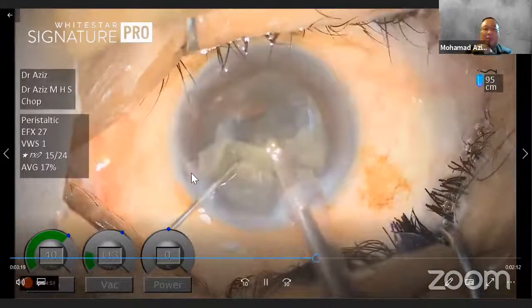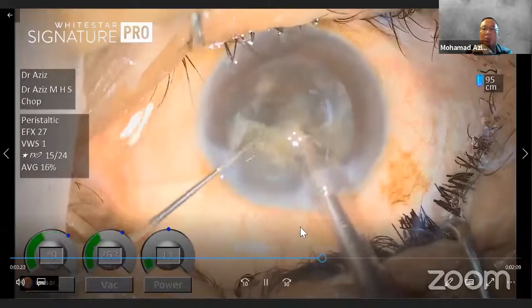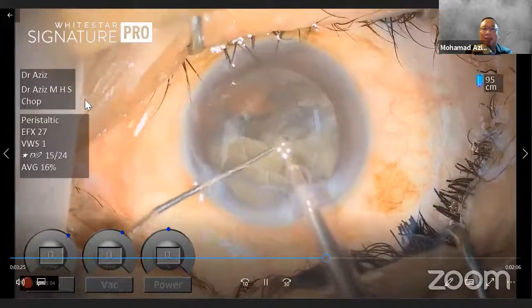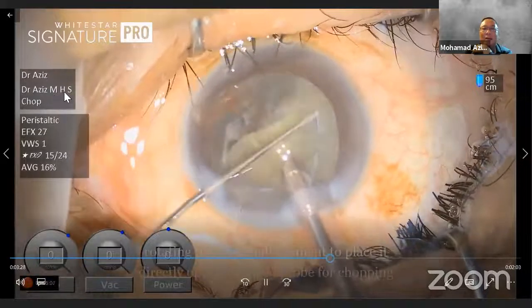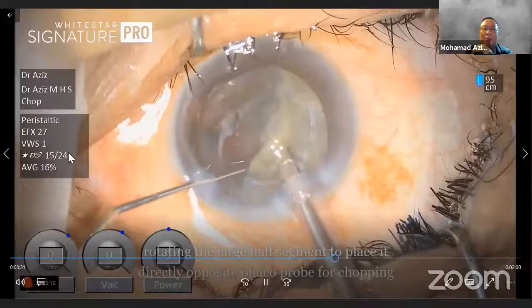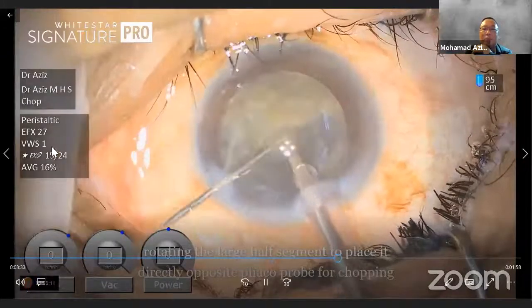Just now, we didn't see White Star 1 come out, or maybe it's because your setting is different. Because this one I set at medium hard soft, MHS. So we change, we play around with the foot pedal, we play around with the on off.